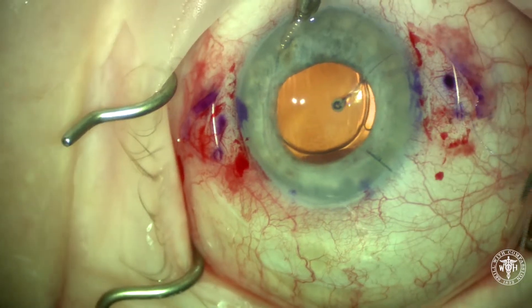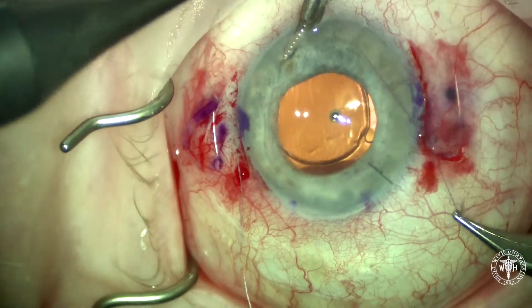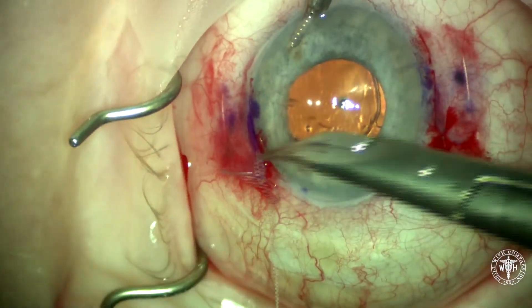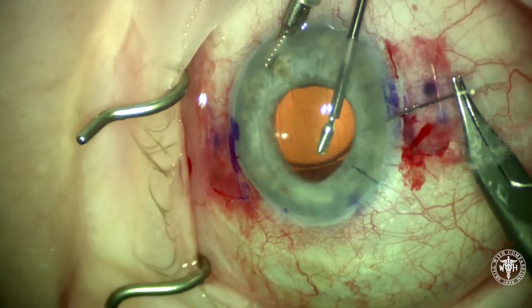I've been recently closing that sclerotomy with 8-0 Vicryl suture. I used to leave them open, but I had a couple of cases of hypotony and I didn't like that very much, so now I close the proximal sclerotomies. The peritomies are then closed using 8-0 Vicryl suture as well.